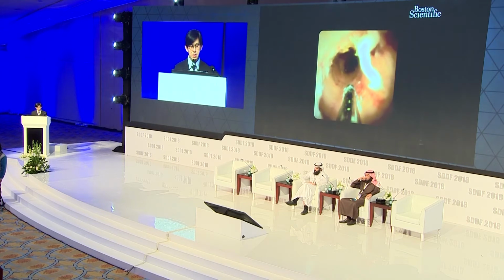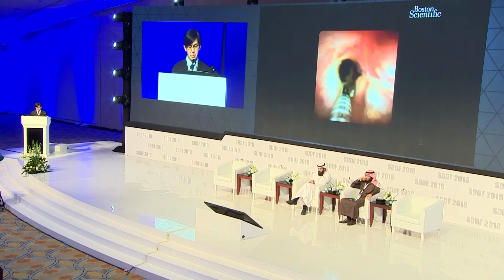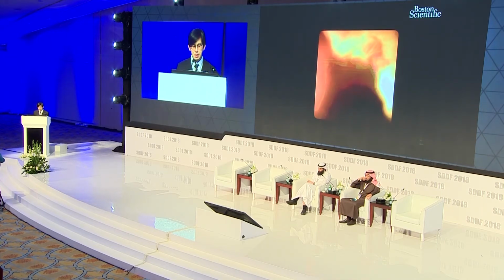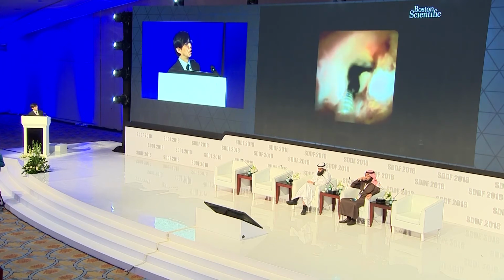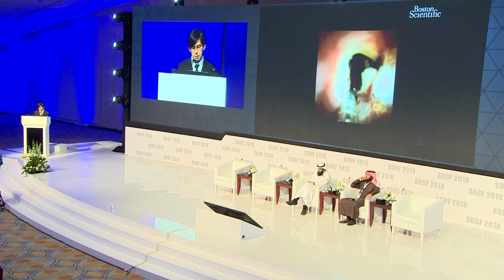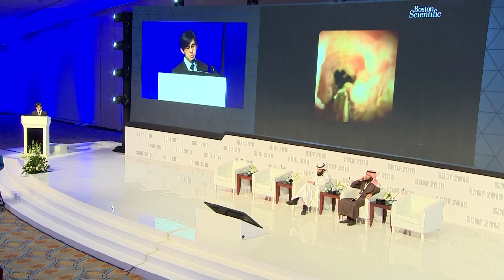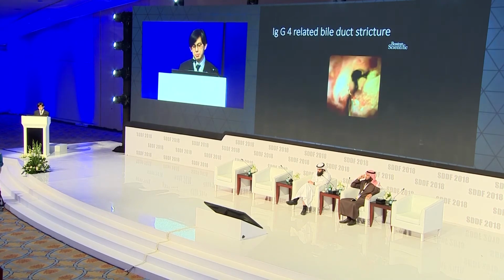This is the left duct, and you do see abnormal vessels, but these are not very typical of the neoplastic vessels that we see. On biopsy and IgG4 staining this proved to be autoimmune cholangiopathy, and the patient responded to the use of steroid, avoiding a Whipple's procedure.